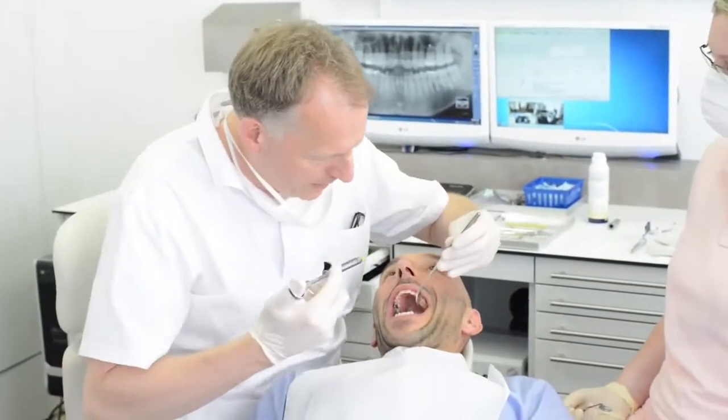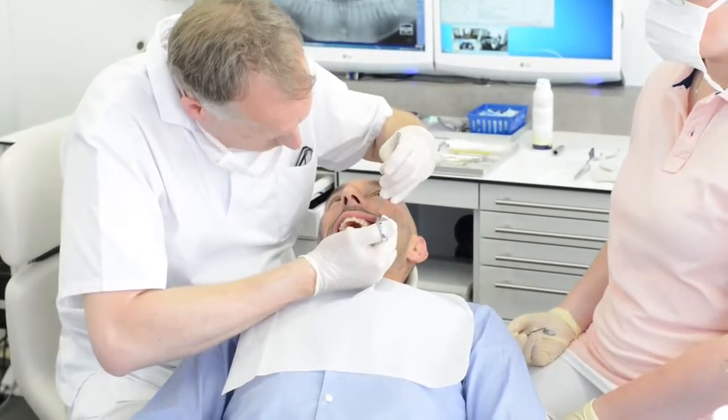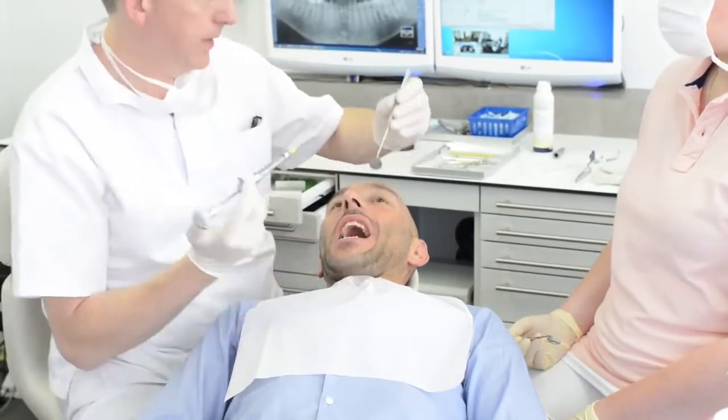While waiting for the injection to take effect and before the patient feels any numbness, we proceed with the buccal scan, highlighting the differences in basic use between the two cameras.